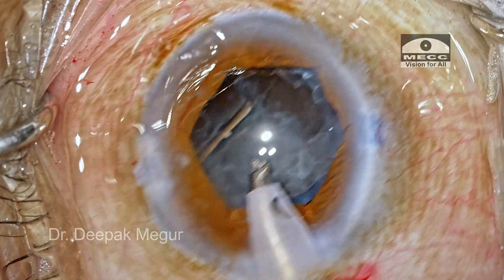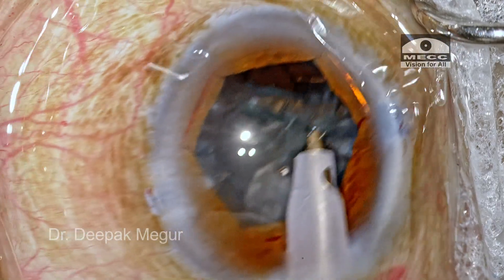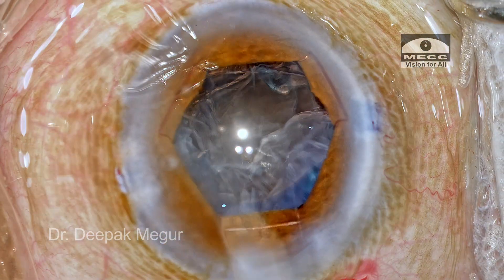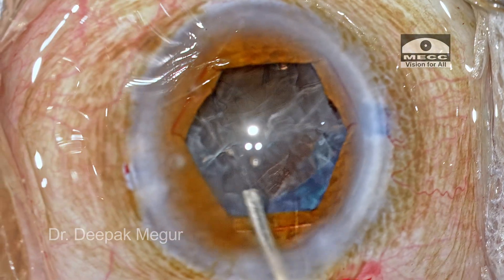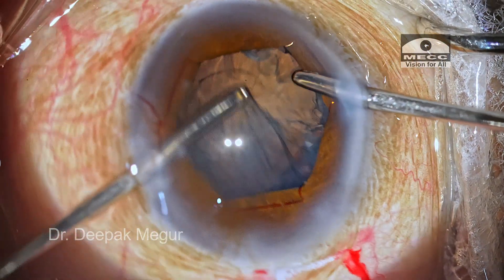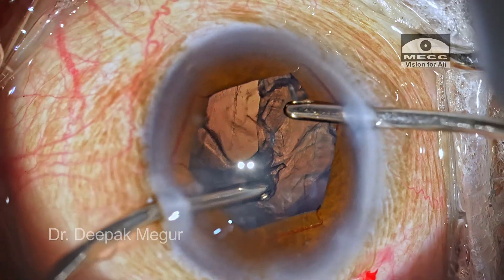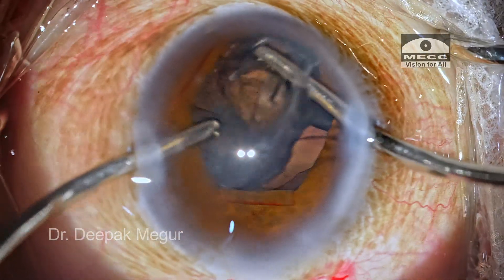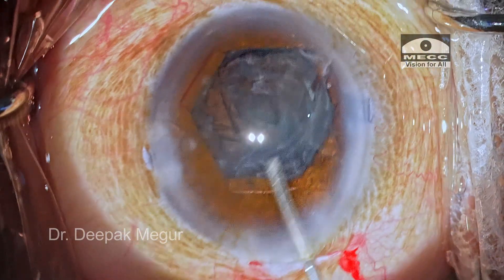Now is the time to remove the epinucleus. The distal portion is removed; however, the proximal half of the epinucleus continues to remain and I'm unable to hold it with the phaco probe. The first go-to maneuver is a repeat hydro procedure to float up the sub-incisional epinucleus, but unfortunately this does not work. My next alternative is to strip the cortex in the sub-incisional area — displacing the epinucleus more centrally. The irrigation cannula goes underneath the epinucleus sheet and floats it up. OVD is then injected behind the epinucleus sheet to push it anteriorly, after which it is aspirated with the phaco probe quite easily.